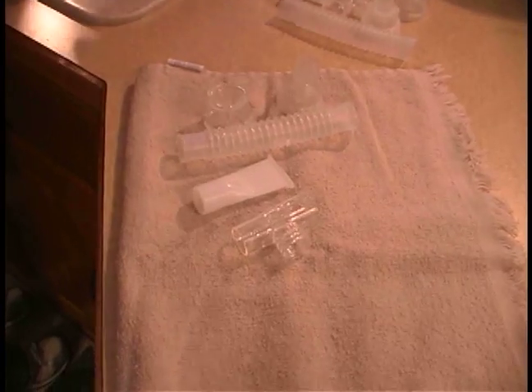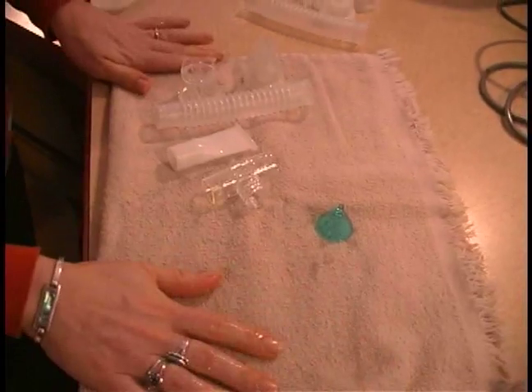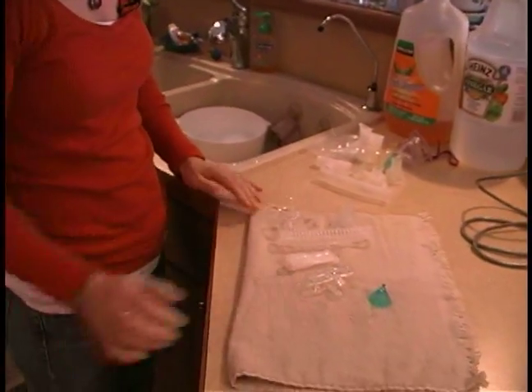Again, this is all part of what's touching the medicine going into the lungs, so we want to make sure that it stays clean. Don't put any of it together until everything is fully dry — just let it sit out there to dry.